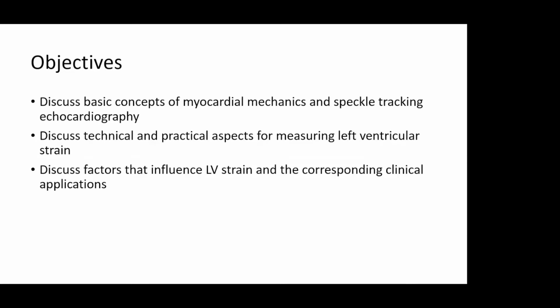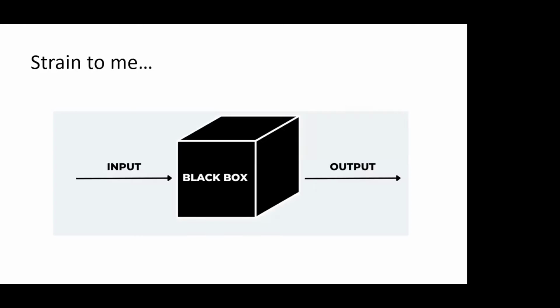And then finally, I'll just discuss some factors that influence LV strain and their corresponding clinical applications. The talk in itself from a clinical application of strain perspective can be very extensive, so we'll only touch on that more briefly, but focus more on the first two objectives.